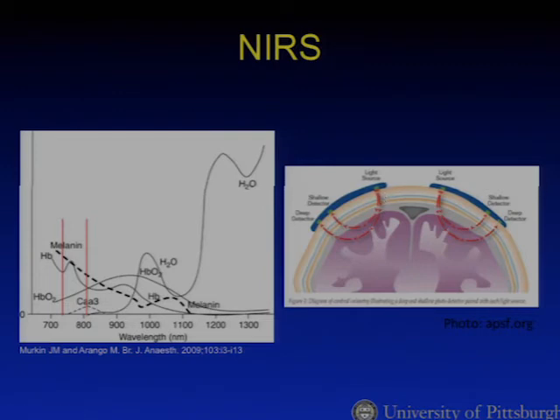Because there's a relationship between the depth of tissue penetration and the angle of incidence of reflected light, this differential spacing here facilitates the use of a subtraction algorithm and gives us some spatial resolution. So we can sort of subtract out some of the extracerebral signal and hopefully get an indication of cortical brain oxygen saturation in this instance in the frontal cortex.